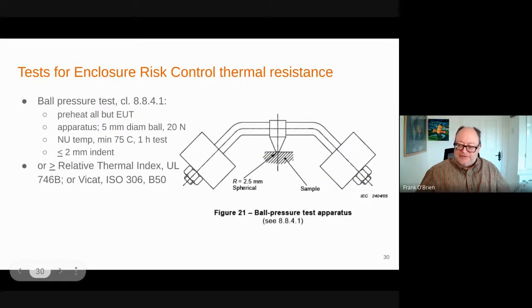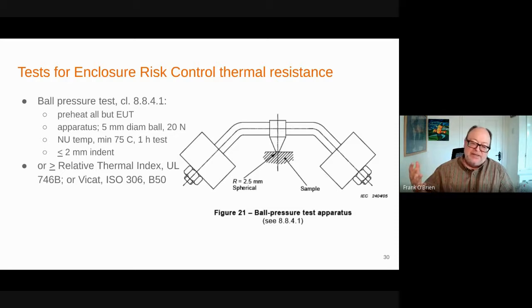So thermal resistance is, if we're doing our risk control job, then one of the components of that job is to verify thermal resistance. And so we could source it with a UL relative thermal index. There's an electric, a mechanical with impact, mechanical without impact. These are explained in the plastic UL recognition for these plastics. So I'll let you read about that. But if you had the temperature rating for the appropriate rating, so an enclosure would be subject to impact, you'd look for a relative thermal index with impact. If you had that, you would probably document that you had sufficient thermal resistance.